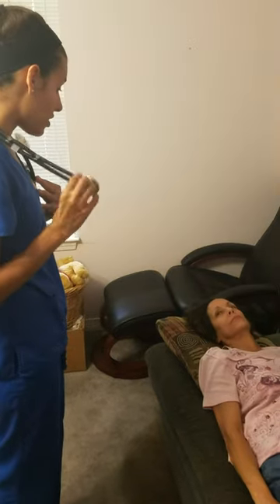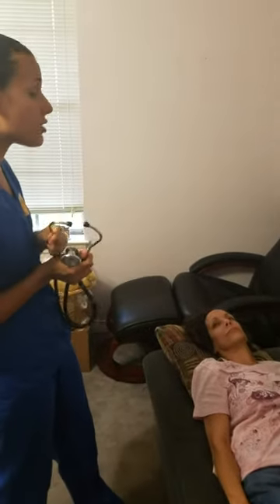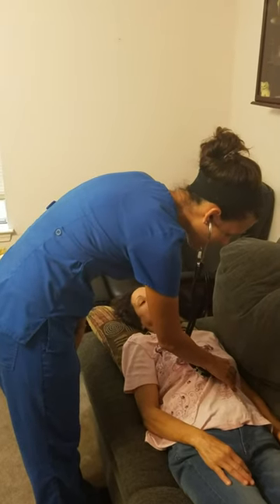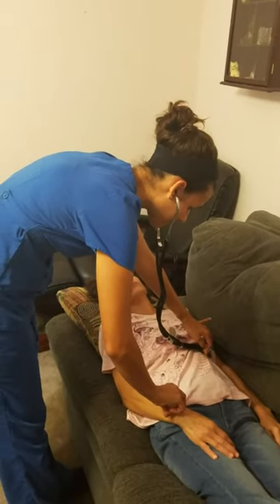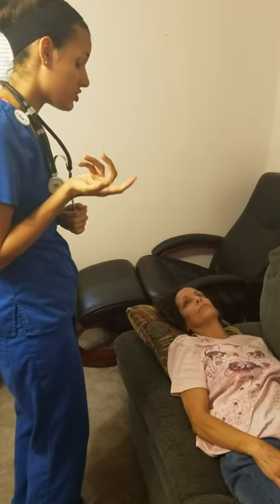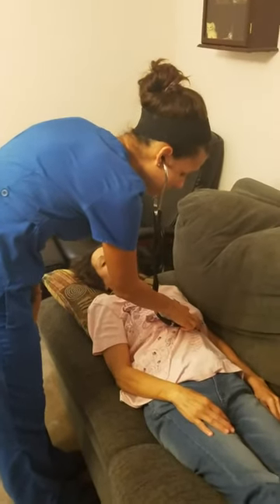Now I'm going to go ahead and auscultate. I'm going to first use the diaphragm of my stethoscope at the apex of your heart to listen to your heart rate and then the rhythm. I want the rate to be between 60 and 100 beats per minute, and I want the rhythm to be regular, so I'm going to listen for a full minute. If I would hear any irregular rhythms, I would go ahead and palpate your radial pulse while listening to your apical impulse — and they should be the same. Your heart rate is between 60 and 100; if it was slower than 60 you would be bradycardic, if higher than 100 you would be tachycardic — and you're not, and the rhythm is regular. I also want to differentiate between your S1 and S2 sounds — S1 is the lub, S2 is the dub.